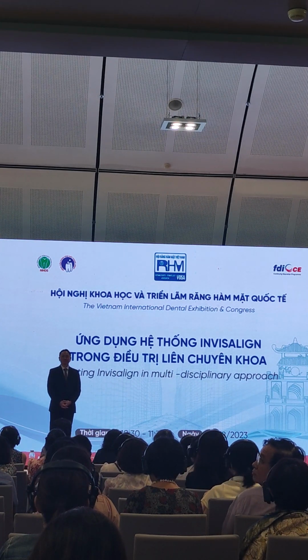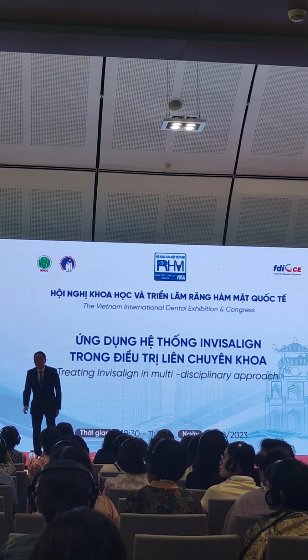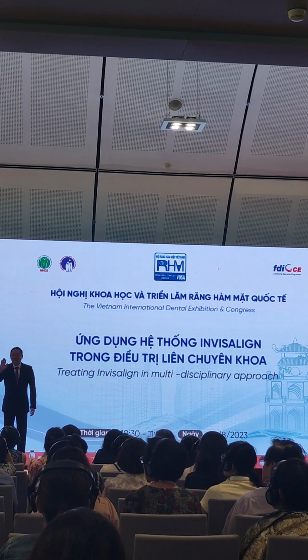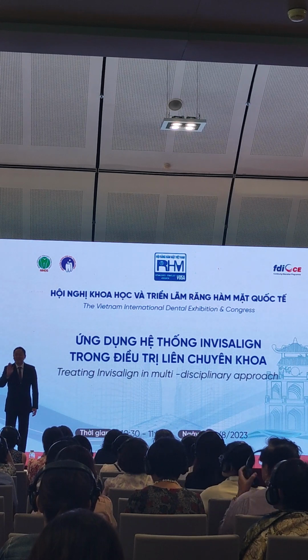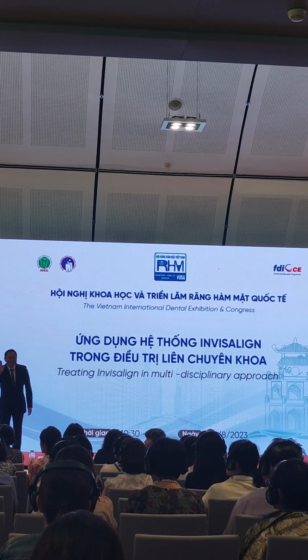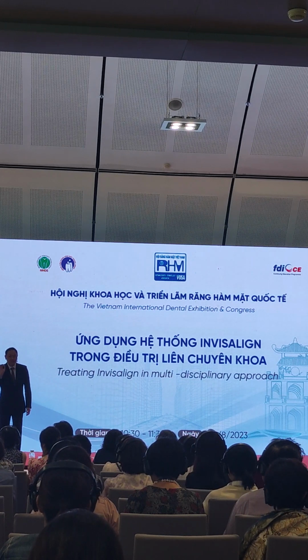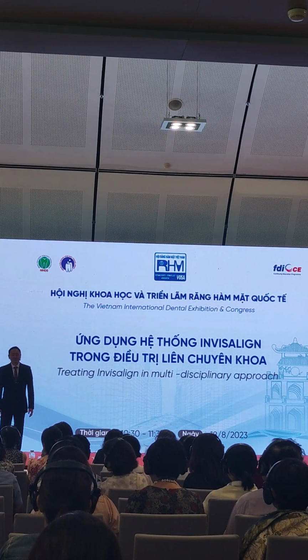In the break, some of the doctors wanted me to ask you that in some of your ClinCheck, it seems like the lower and the upper teeth overlap each other during movement. So please ask again. I thought you were translating, so please ask again. Okay, sorry. So during the break, some of the doctors want me to ask you that in some of the ClinChecks, there seems to be an overlap of the lower and the upper teeth during movement. So do you have the patient wear aligners while they eat?